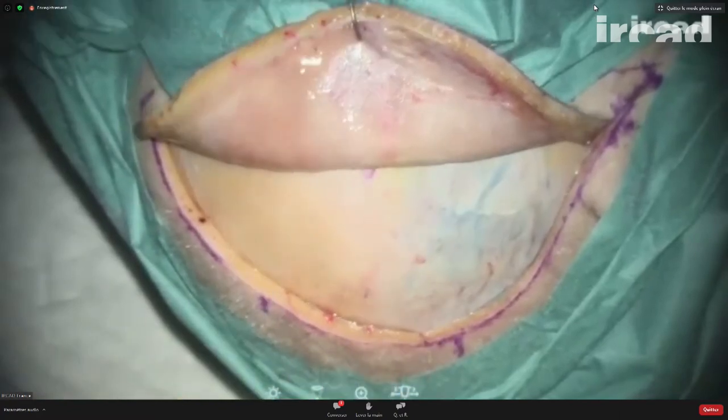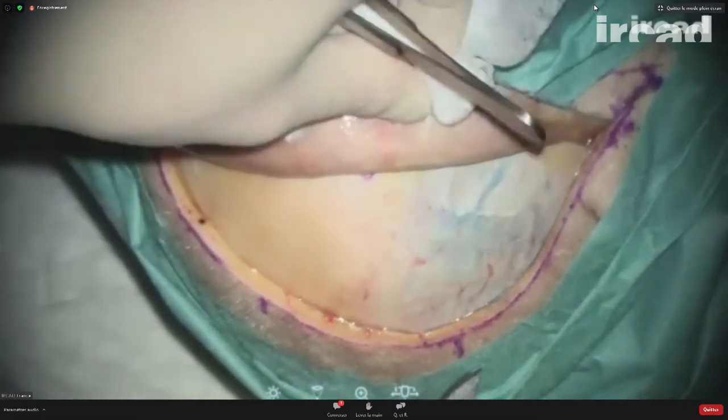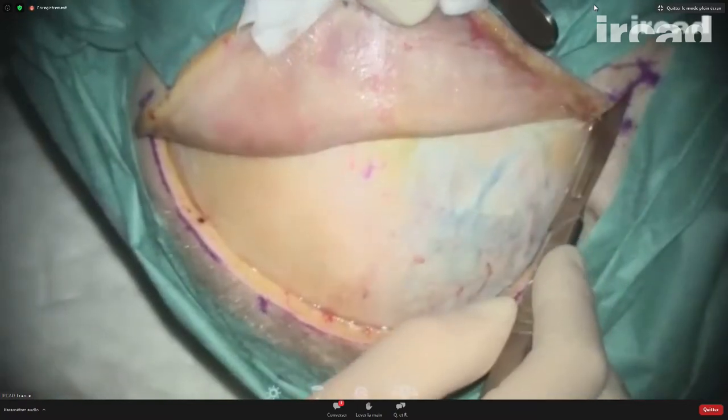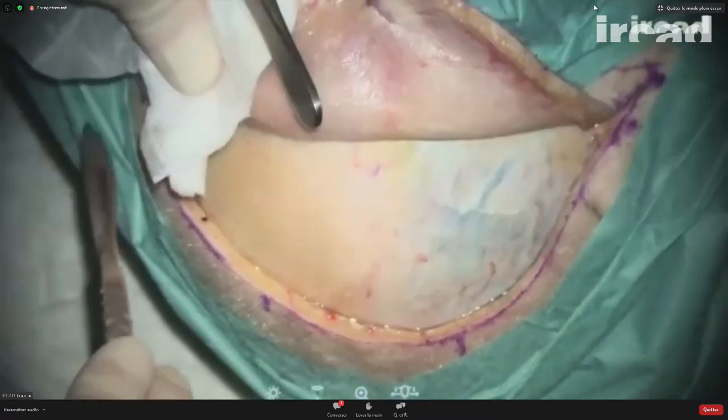It's important to keep the periosteum covering the bone intact here. There is a thin layer of periosteum in order to use it for closure of the dura at the end.